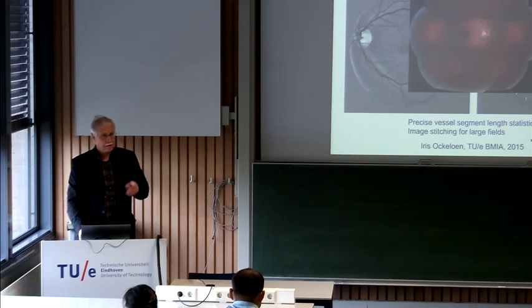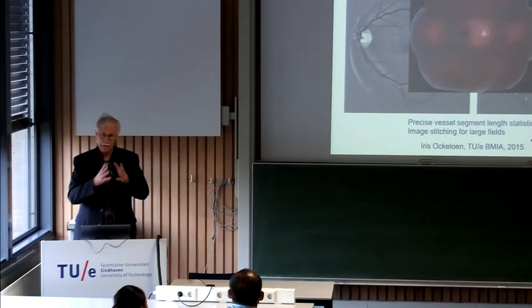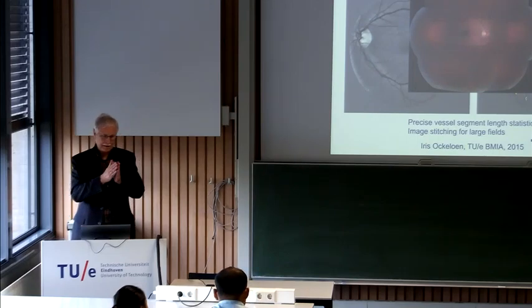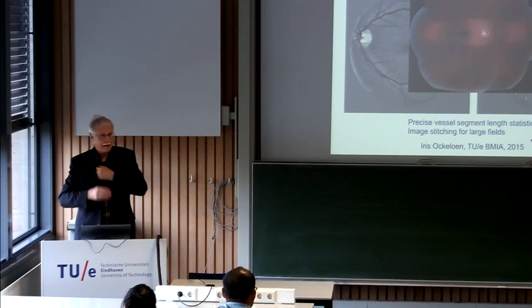And with screening, you need to see a large area. Suppose I want to see some melanoma, and if I only see this small part of my hand, it doesn't make sense. You want to see the whole body and also the whole retina. Today you have cameras that have laser scanning, and they can scan 160 to sometimes 180 degrees. It's very nice. It's called Optos. And Optos has some fantastic websites, nice to see how you scan the complete background of the retina.